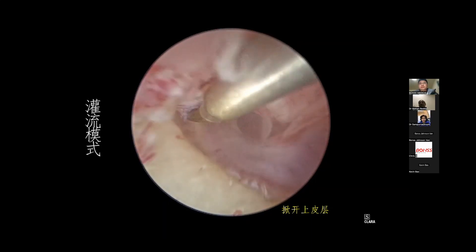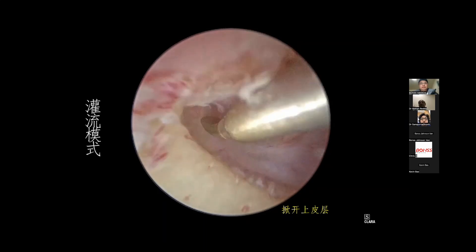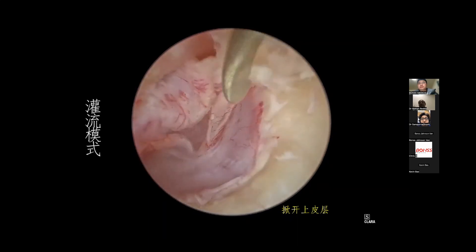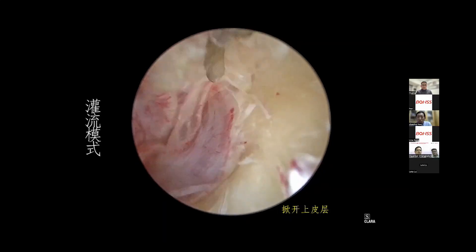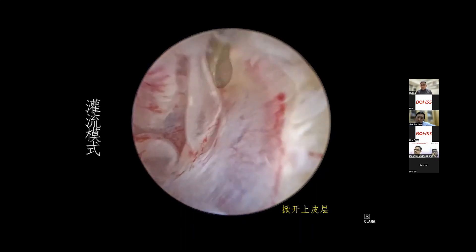If you want to finish the inlay technique, you have to lift up the epithelial layer around the perforation 360 degrees, just like this.